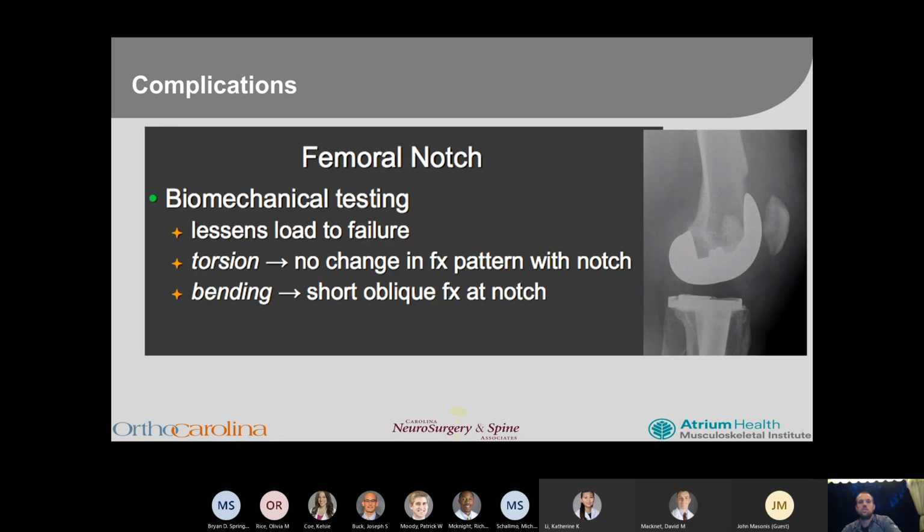Femoral notching, you can see here on that total knee, essentially comes during preparation for the femoral component. If you cut too aggressively, and that is a risk factor for periprosthetic fracture postoperatively. Typically, if they ask you about this, they're going to show you an x-ray and count on you to pick that up. So you have to look kind of along the anterior cortex here. And if you're looking along there, you can see that it kind of takes a dive there because essentially the saw was coming in along this trajectory and came in too deep. So that's what femoral notching is. And if you see that, you will be at risk of a fracture down the road.